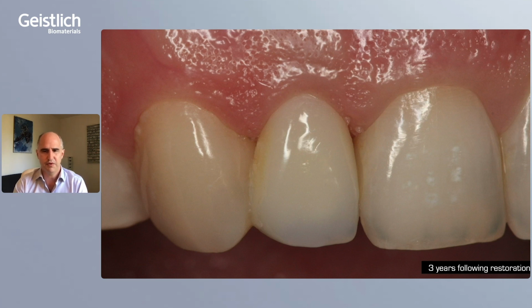Here's the situation 3 years down the road. You see literally no change over time, so there seems to be stability in these cases, and we know this then if you graft with bio-os that there is a stability in these sockets.